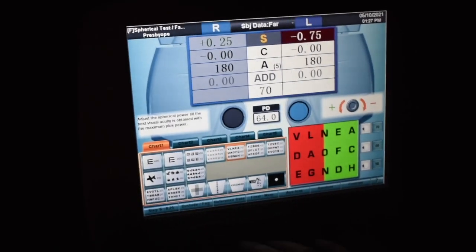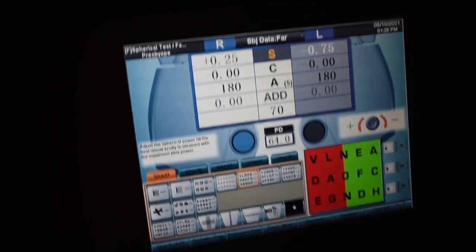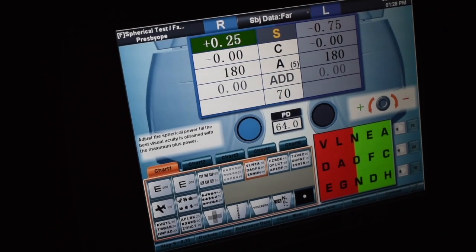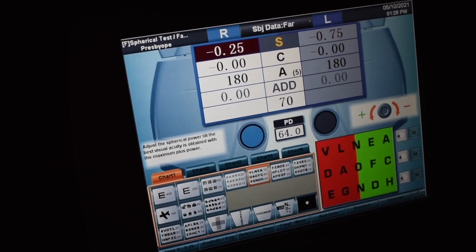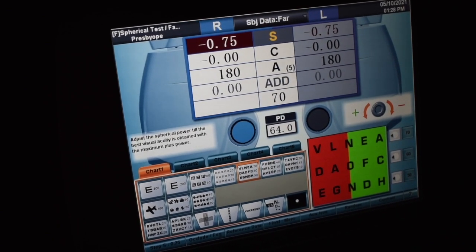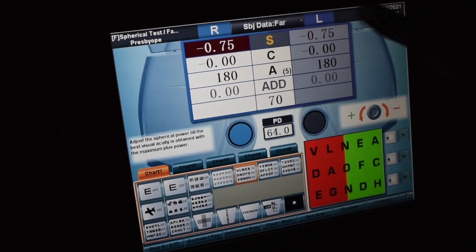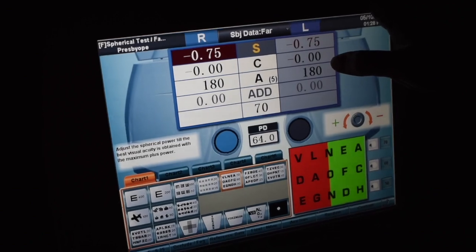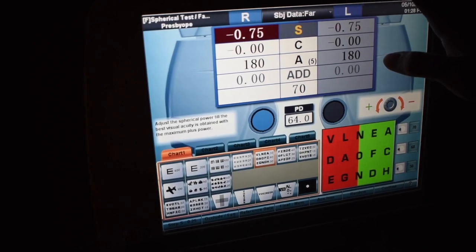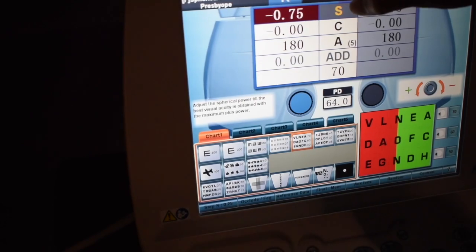Now we're going to go ahead and do the right eye. Looking out at that screen, which side is clear — the red or the green? Patient responded: red, red, red, red, green. So we're going to leave it on the green here. We would actually take VAs here, but in this case we're going to move on to the JCC. Just remember in procedures, you would take VA.